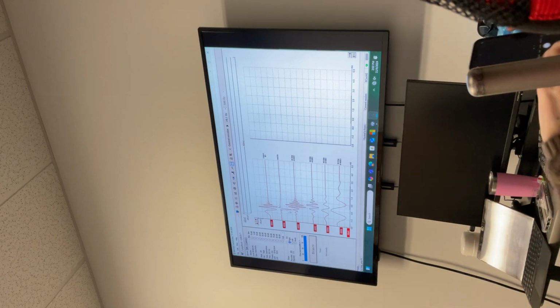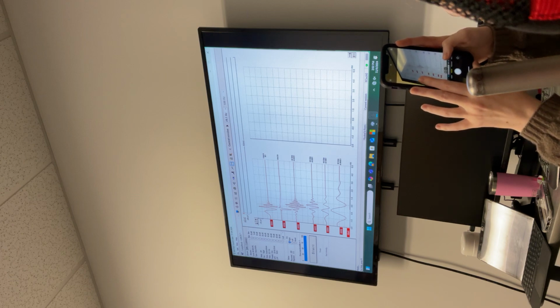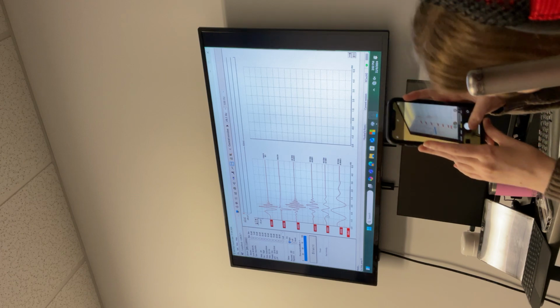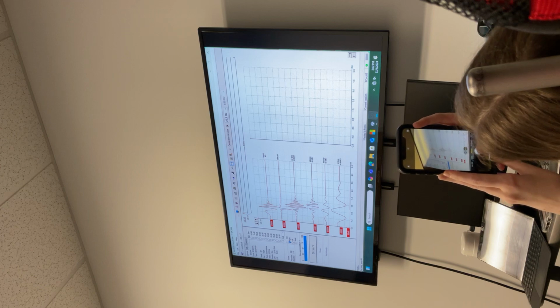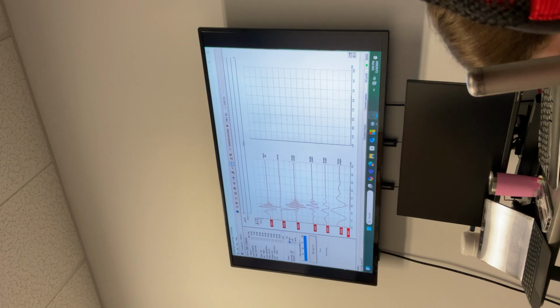You can see 4000 hertz, not much shift because it's very similar to click. The same thing with 2000 hertz, whereas if you look at 1000, there's still energy going on before that. Even for 500 hertz, there's so much. Okay. So this is exclusively for the CE narrowband chirp, for all the chirp family.